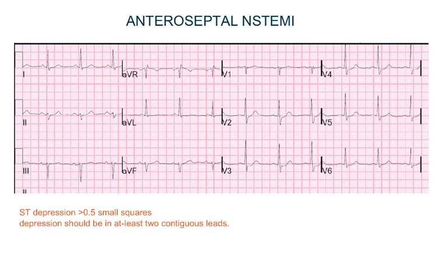To diagnose ST depression MI, the depression should be more than 0.5 small squares and should be in at least two contiguous leads. For example, in this ECG the depression is in lead V2, V3, and V4, so this is anteroseptal NSTEMI.